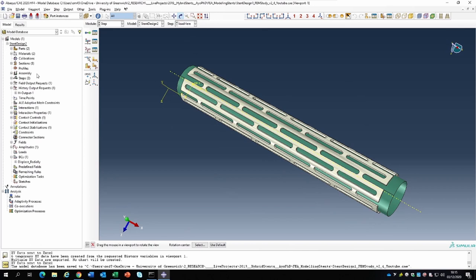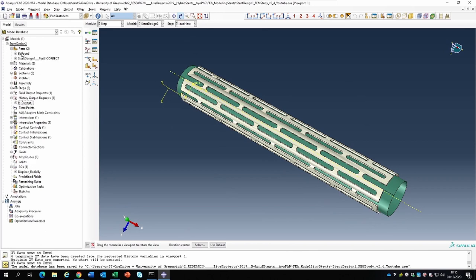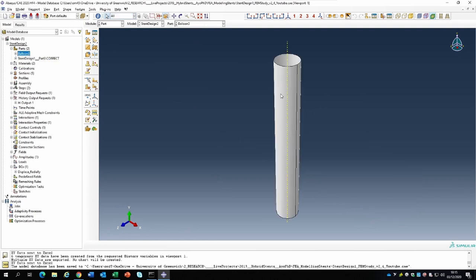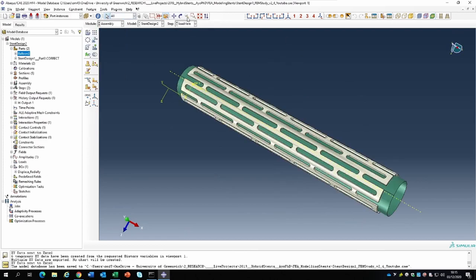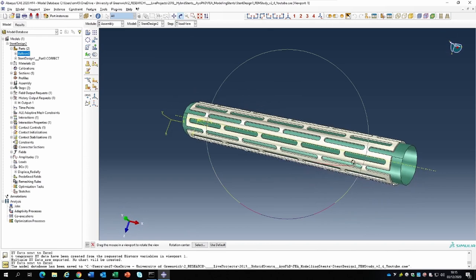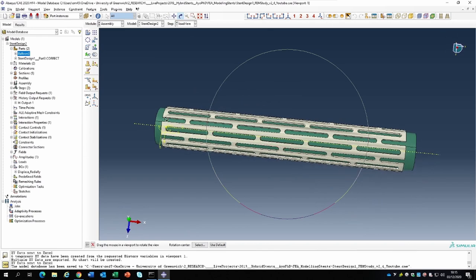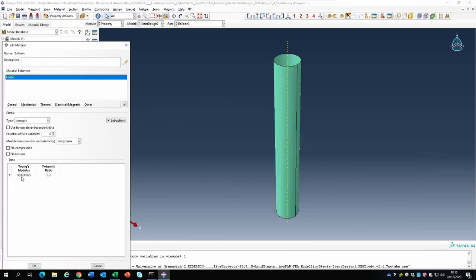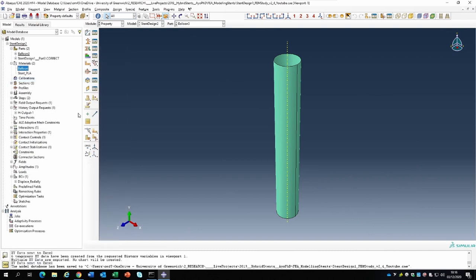Running through information from the previous video: we imported this stent model from a CAD version. We created the balloon and centered it right in the middle so it could expand and create the deformation we wanted. We also created a property for the balloon - material properties of 0.9 gigapascal and Poisson ratio 0.33, considered elastic. You could improve that by making it hyperelastic, but for this simulation we are working with only an elastic material model for the balloon.